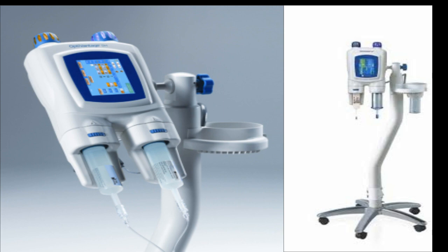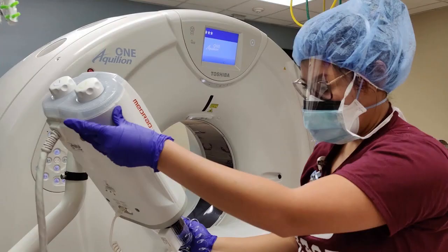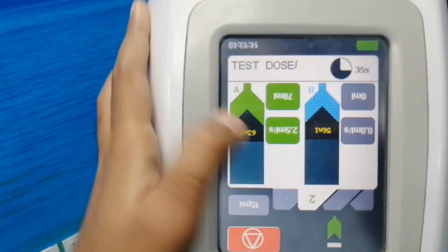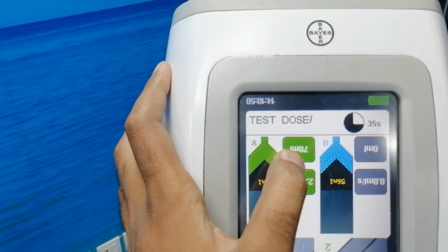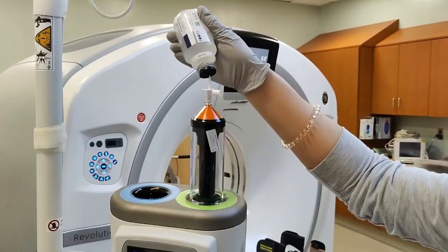A CT scan dual injector refers to a medical device used during a CT scan procedure. A dual injector has the capability to deliver contrast media into the patient's bloodstream at a controlled rate and volume. It typically consists of two syringes. The purpose of the dual injector is to provide contrast enhancement for specific imaging procedures or protocols.